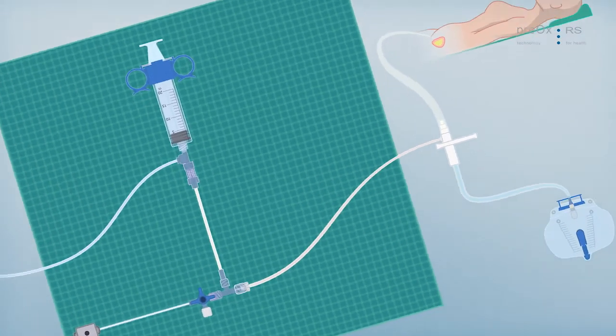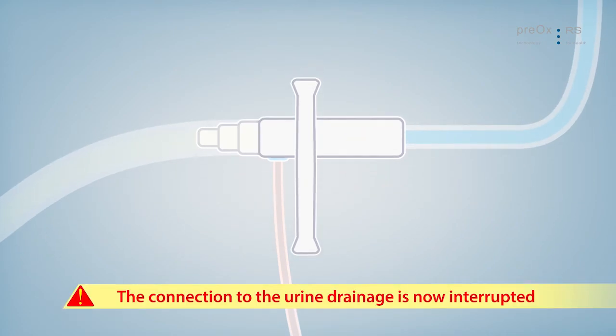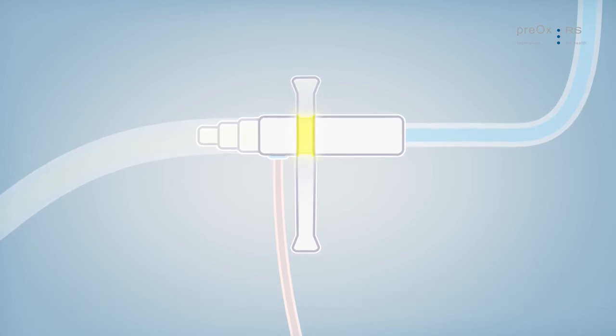Now perform the measurement. Interrupt the urine drainage by closing the white clamp of the IAP adapter. Make sure the clamp is in the foreseen notch.